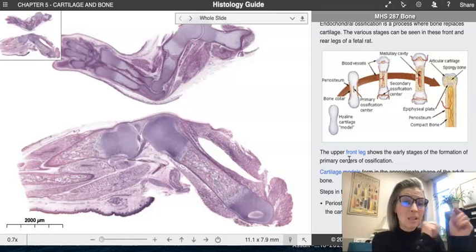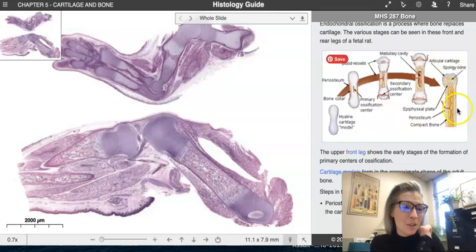What we do see is a chip of the bone. We can go in and chip this off, and that would be essentially your ground or compact bone slide with all the osteons and the India ink that we saw before. And so where are we with this?